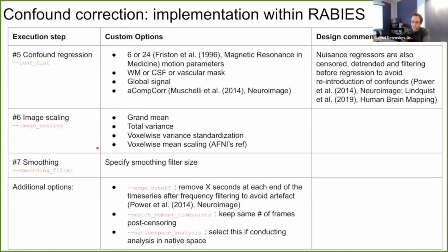And unfortunately, again, this is a stage where there's definitely no ground truth. It's actually a stage that I'm quite struggling with making accurate decisions myself. So if you have some experience and insight on this, please reach out and contribute to these decisions. But overall, by default, I guess the simple go-to method might be to simply scale the image relative to the grand mean intensity, so that the mean intensity of your image is comparable between your different scans. That's what different papers using dual regression are generally doing, at least with the FSL group.